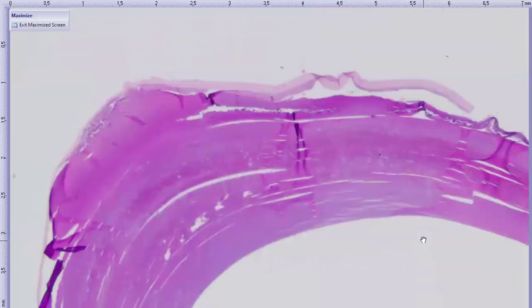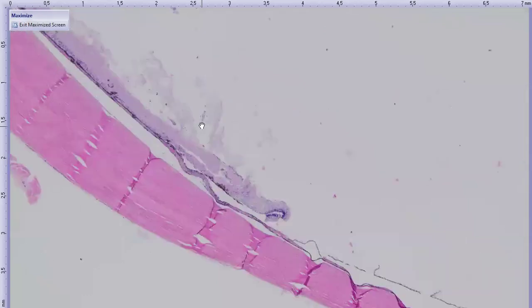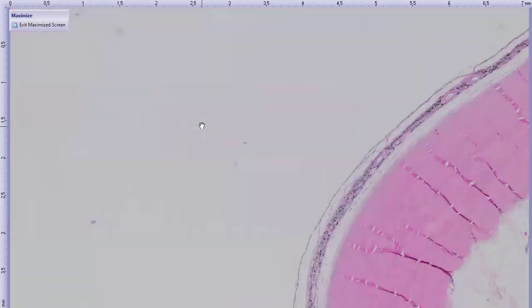This horse also had a cataract. You can see some mineralization in the cortex, even from low magnification, but we'll just zoom back to the back of the eye to take a look at some of that. Wait, that's the ciliary body. Here we go.